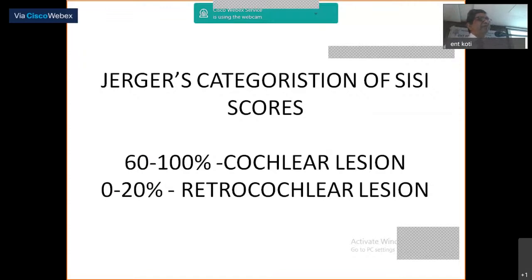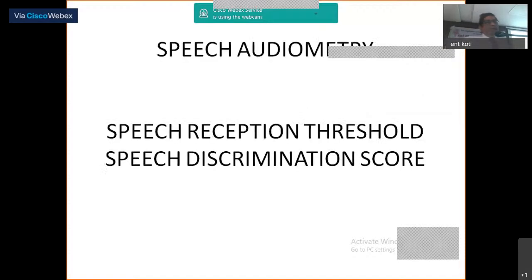This was before the advent of CT, MRI, everything. So these were the earliest things. Now, because it needs the subject's participation, and nowadays nobody has the patience to sit for all this, they are all slowly going out of routine. Okay, now come to what is called speech audiometry.